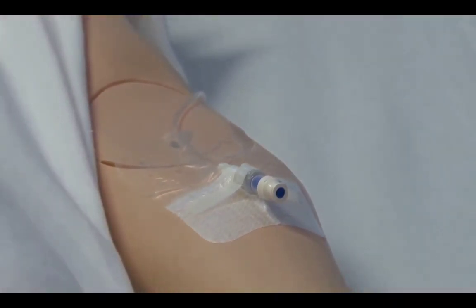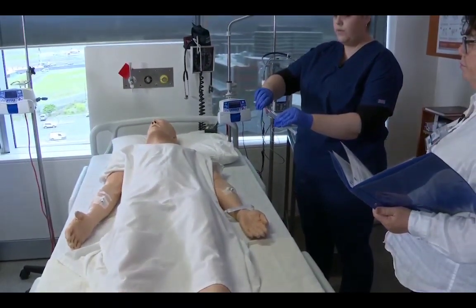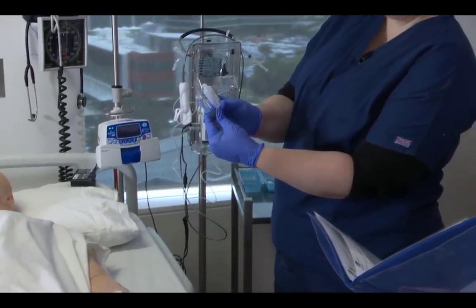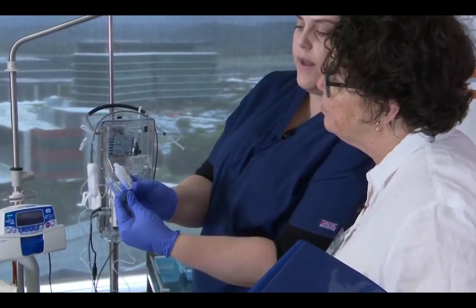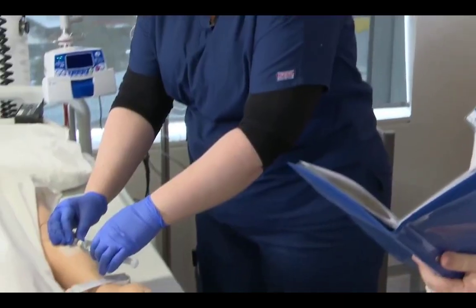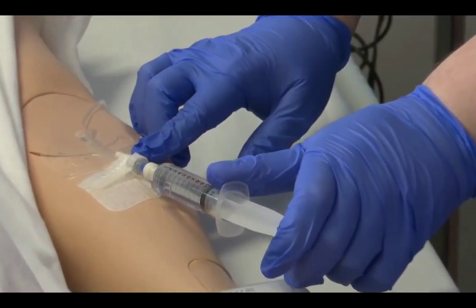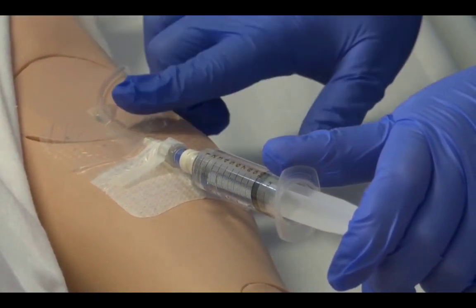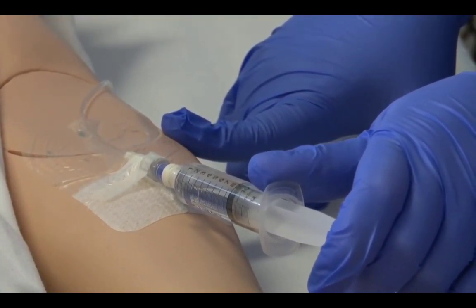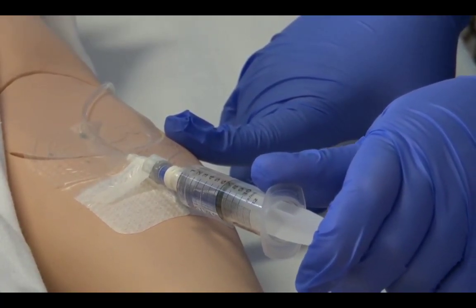And I'll be leaving that to dry for a full 1 minute. I'm then going to remove the red needle from my flush. And this is my 3rd check that I've got sodium chloride 10 mils, expires 2025 for a flush. Correct. Okay. And coming to my cannula, luer locking on my syringe and flushing my cannula. John, this shouldn't hurt at all, but it might feel a little bit cold as it's going in. Is that feeling comfortable? It is? Okay, great. So it's just pushing in just slowly, slowly, but I'm very happy with how that's flushing.